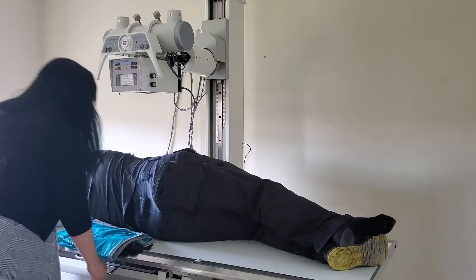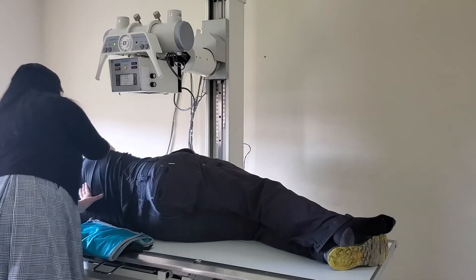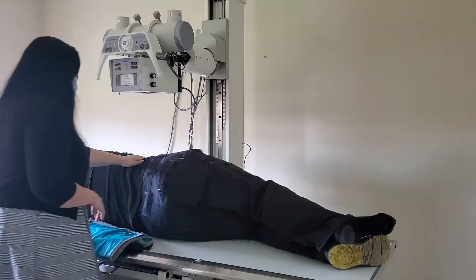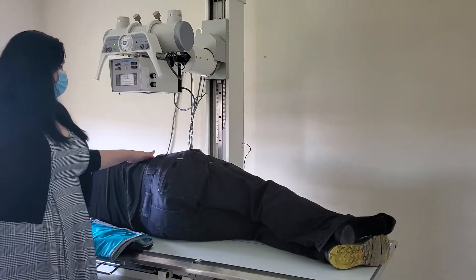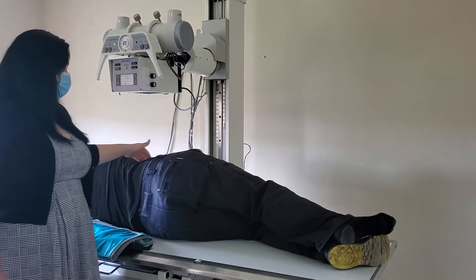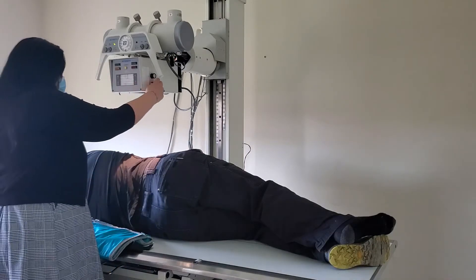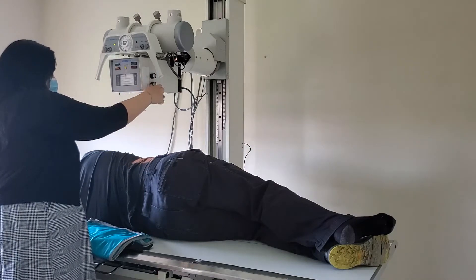Put your left marker on and make sure your patient is still in true lateral. Go through and make sure that the shoulders and hips are aligned with one another. Use the back of your hand, and then you're ready to center. The centering point is two inches posterior to the elevated ASIS and an inch and a half below the iliac crest. A perpendicular beam is recommended to begin, and collimate your field down quite small.